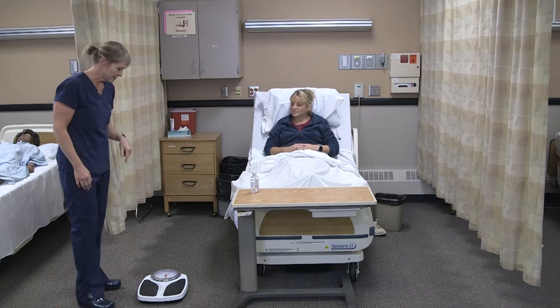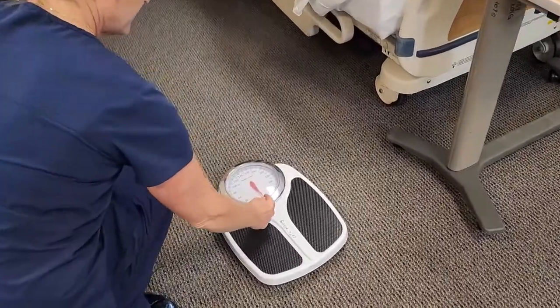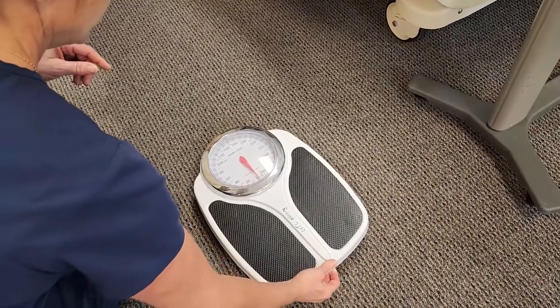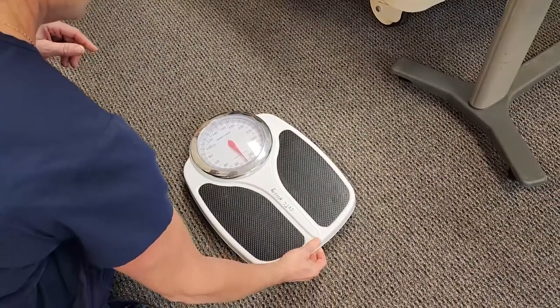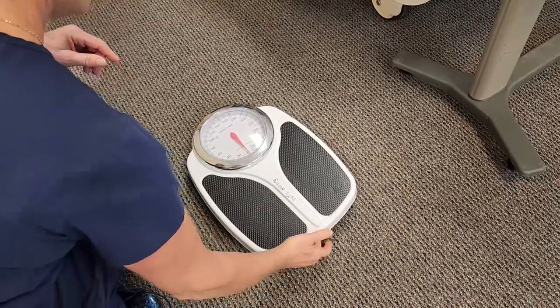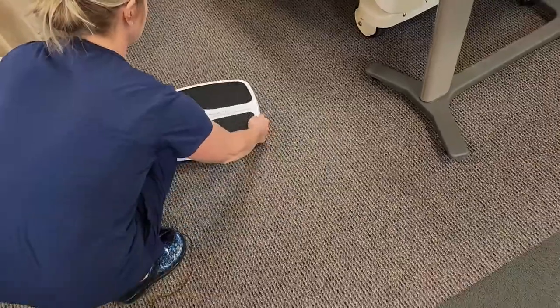Before I have you get out of bed, I'm going to zero the scale. If I look at the red needle here, it's a little bit above the zero. This particular scale has a dial underneath where I can move that needle back and forth to zero the scale. I turned that dial a little bit, and now we're right on zero. So now I'm going to turn this so it's easier for Annie to get on.